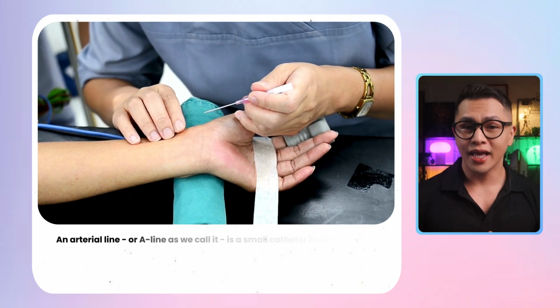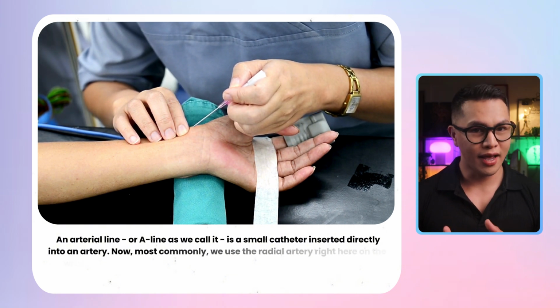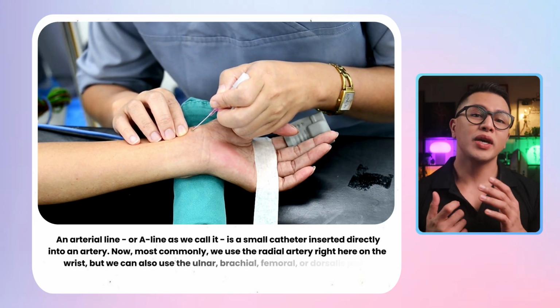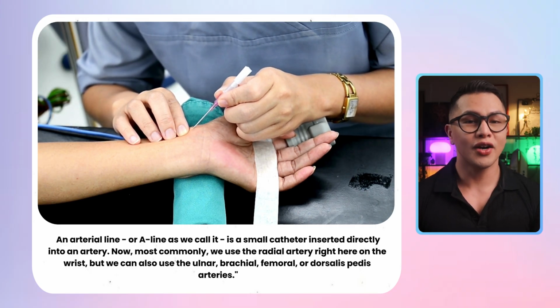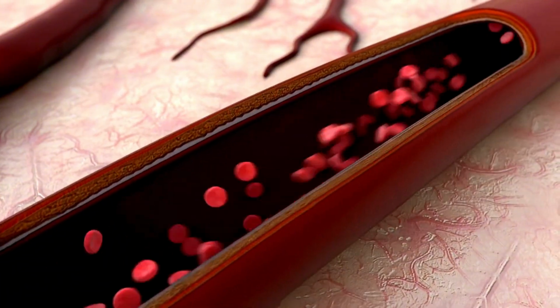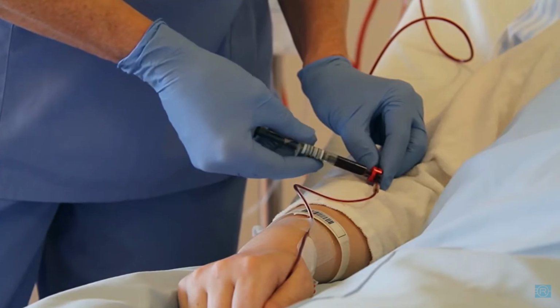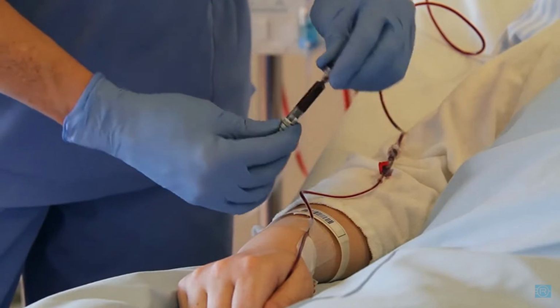Alright, let's start with the basics. An arterial line, or A line as we call it, is a small catheter inserted directly into an artery. Now, most commonly, we use the radial artery right here in the wrist, but we can also use the ulnar, brachial, femoral, or dorsalis pedis arteries. But here's the critical part that everyone needs to understand. Arteries are your body's highway for oxygenated blood. So before we ever insert an arterial line, we must ensure there's collateral circulation. This is why we do the Allen's test for radial artery cannulation.